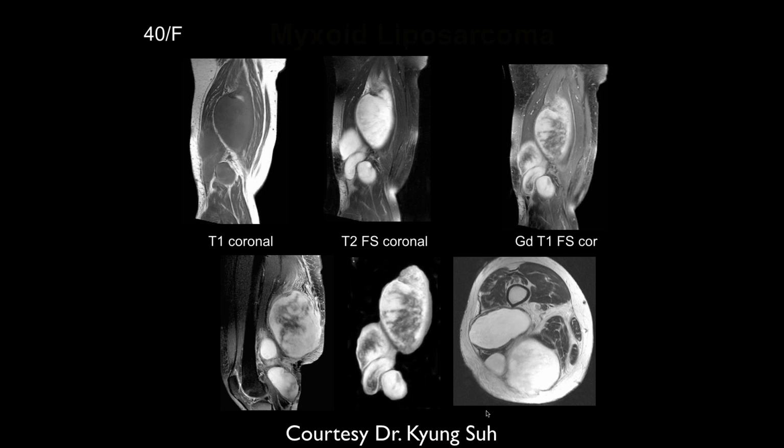Yeah. So myxoliposarcoma. Okay. So this is a liposarcoma. The size, the irregular growth characteristics, the inhomogeneity are all suggestive. And again, most malignant lesions are not going to be full of fat like we see in the typical lipomas. They tend to be lower in signal intensity, though you can see some areas of fat within it, which kind of goes along with the histologic diagnosis of liposarcoma.